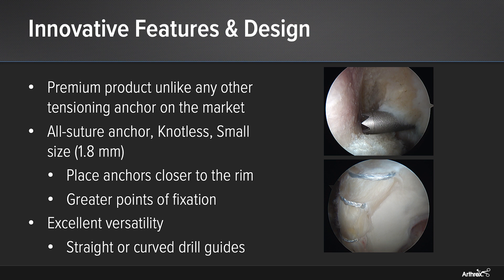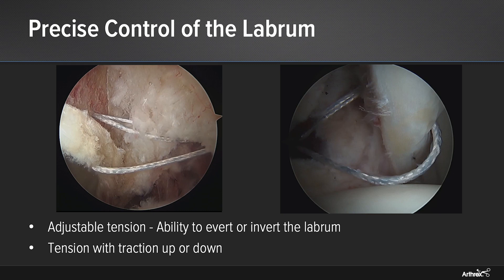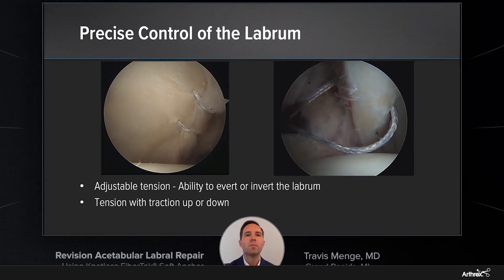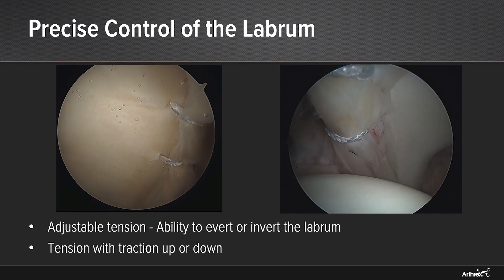We get a repair which, in this case a revision repair, offers no knot stacks, perfect tension, and perfect anchor placement. You can see in these videos, starting with the video on the left, these anchors also offer excellent precision with control of the labrum and your repair construct. The video on the left shows the ability to invert the labrum during your repair, versus the video on the right where we can evert the labrum during your repair. This adjustable tension allows you to precisely control your labrum with either eversion or inversion and get the repair perfect every time. Furthermore, you can tension these anchors with the traction up or down, allowing you to get the perfect suction seal between that labrum and the femoral head.